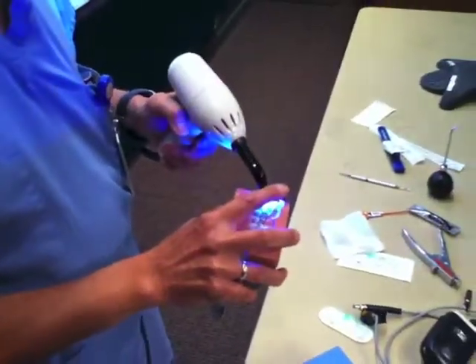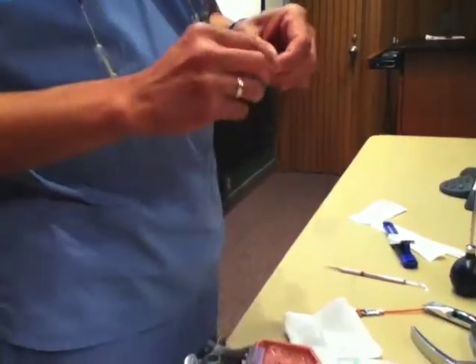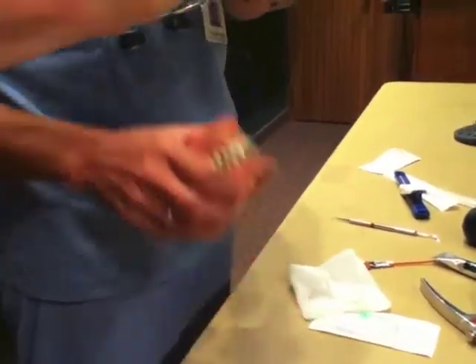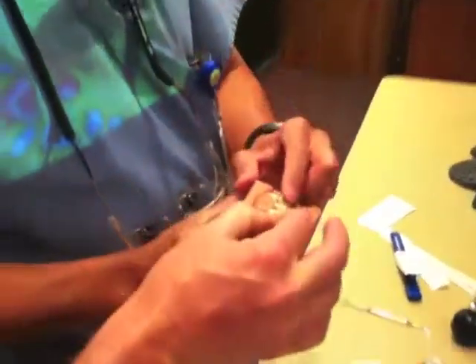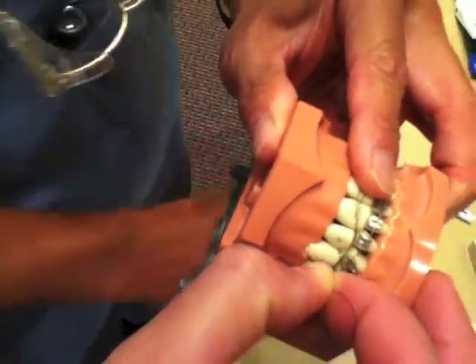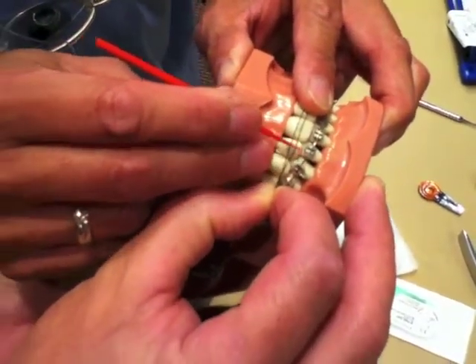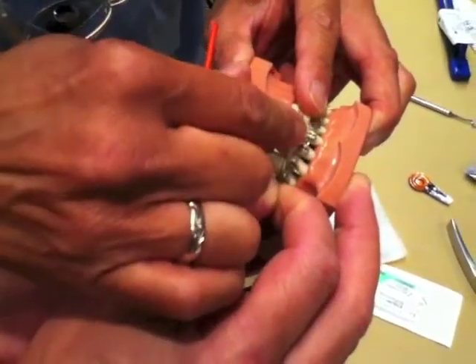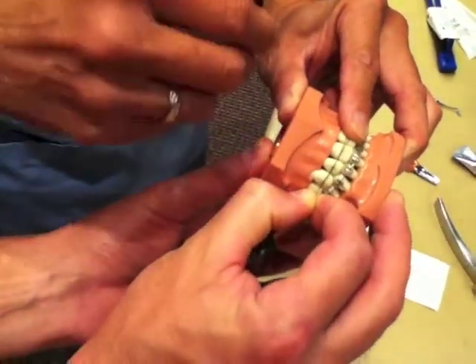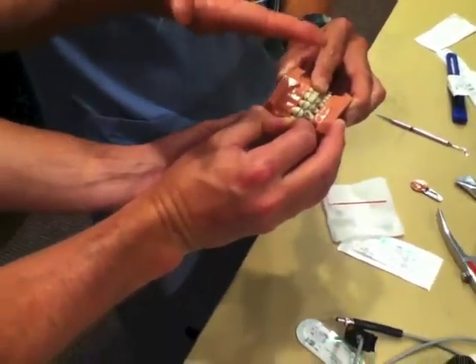Now we're going to lay that suture across the tooth. You can passively lay that on the tooth. Take more of the material — get the suture wet. The material we're going to be using comes again in another little syringe, and we're going to layer some of that material on there.